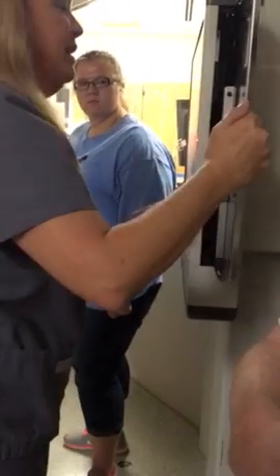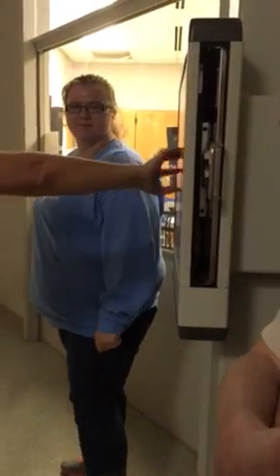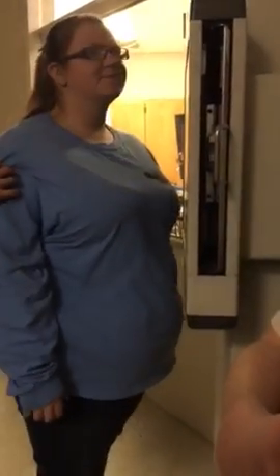I don't want to hit you, Zach. I'll pretend it's in there. Let's turn facing this way. So this side is hurting. Her left side's hurting, so face us.